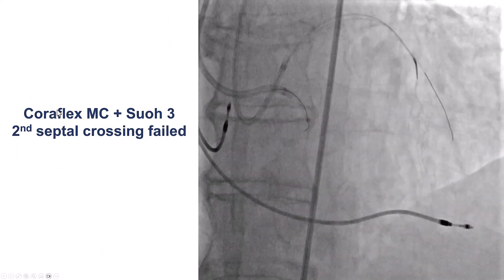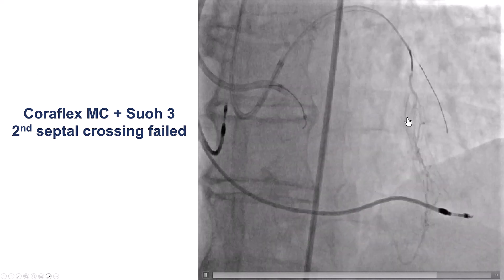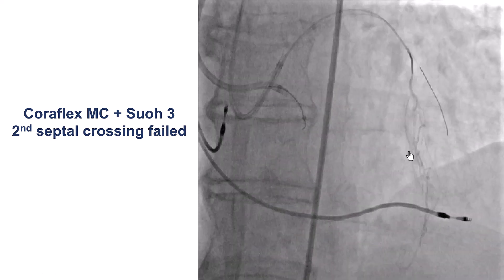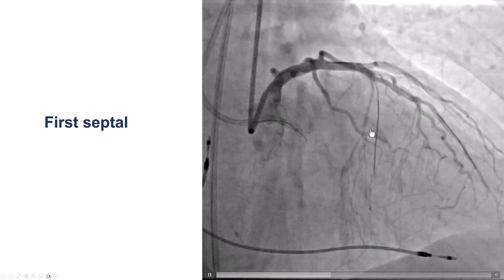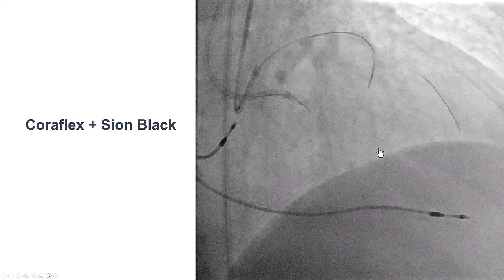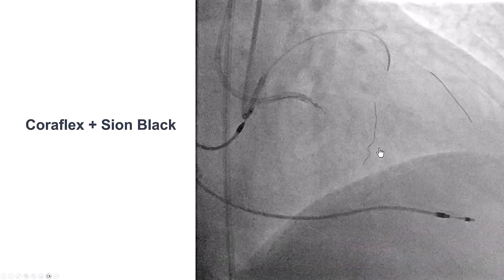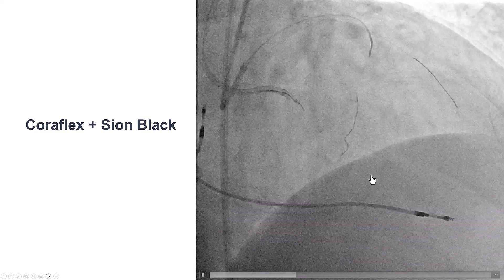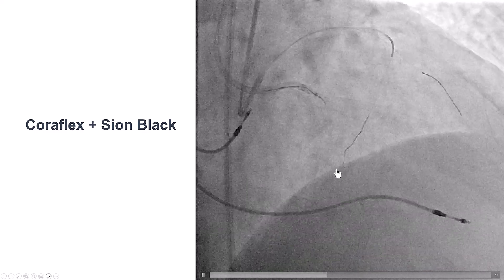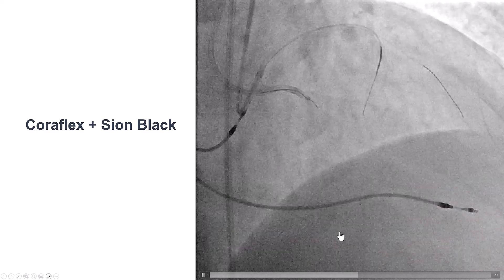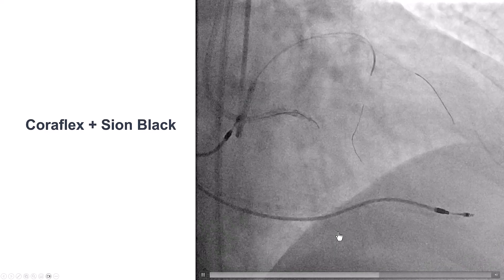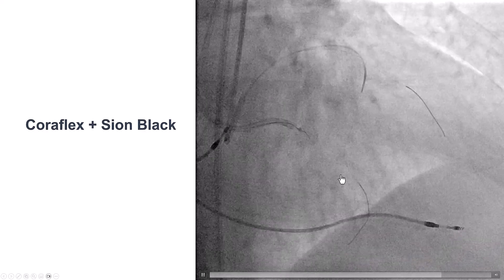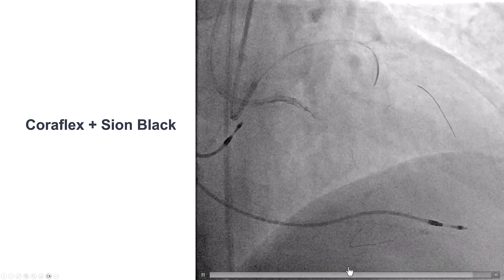We used a Coraflex microcatheter and the SUO3 guide wire. We surfed the second septal that was connecting, but it had a lot of tortuosity and we were unable to cross that septal collateral. We then switched to the first septal and did surfing again, using a Sion Black guide wire. After rapid turning and advancement, the wire found its way going towards the right posterior descending artery. This is an example where surfing can be very useful — multiple turns had to be negotiated before finding the connection with the distal vessel.